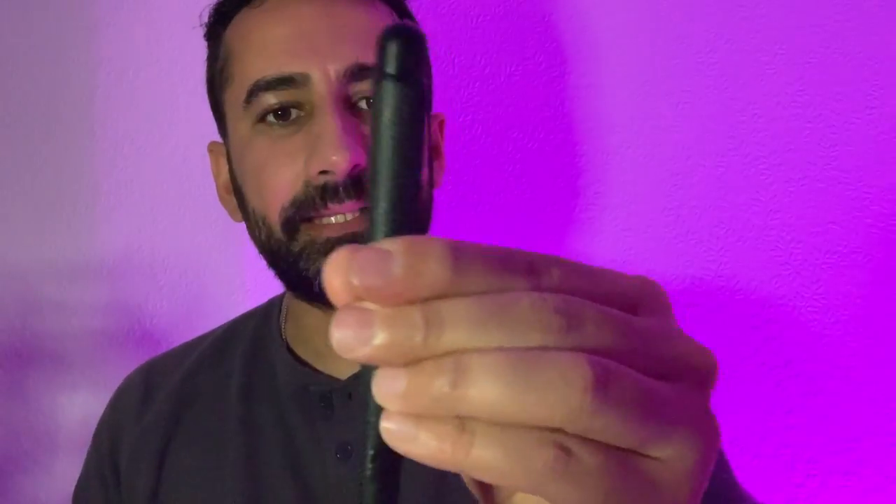I'm going to occlude the other one — just looking for an eye turn there. And the black one with this beautiful knurled grip here for secure handling and comfort. We cover one eye and then we can do a swinging cover test or alternating cover test, checking for a phoria. So those are the two occluders.